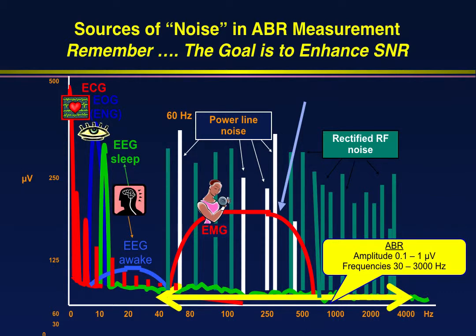Sometimes muscle artifact is very low frequency, sometimes it's very high, but when a child is restless, there's just no way you can filter that artifact out. So there is some artifact we can filter out, and some electrical signals we definitely can filter out, but not usually muscle artifact generated by a wiggly patient, a restless child.